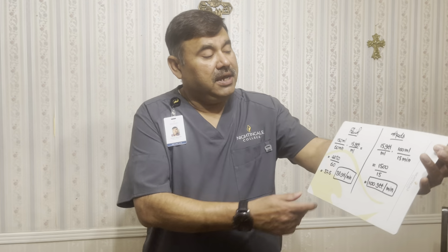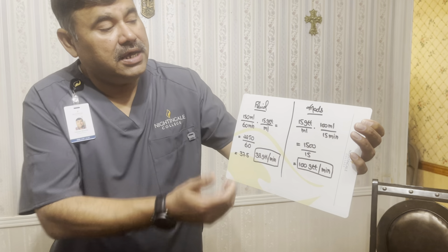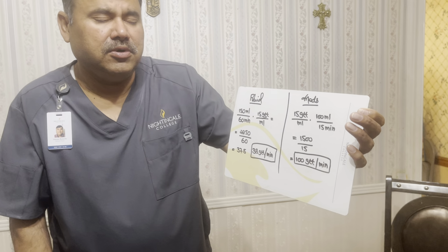Hello friends, my name is Isaac and today I'm performing a skill video on intravenous fluid and medication administration. Before I start, I got orders and I did pre-work. What I'm going to do is hang up the fluids and hang up the medication, that is amoxicillin.